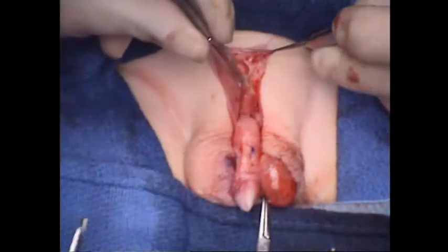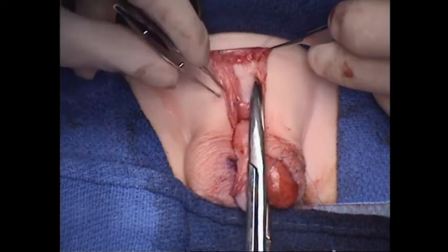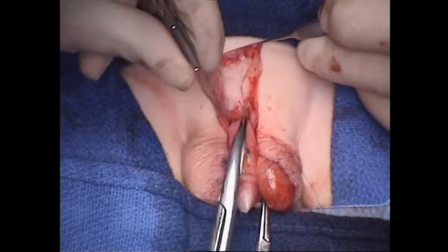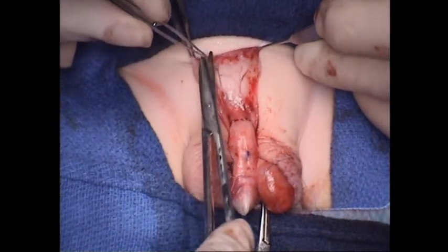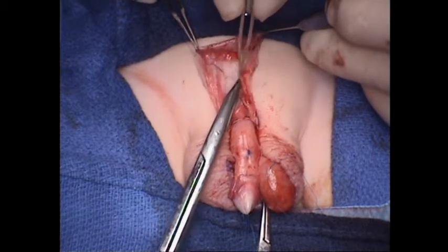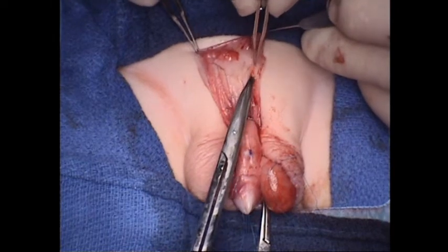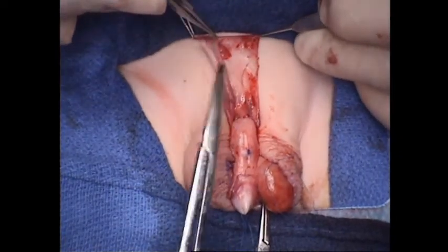So we'll watch as removing this dartos tissue starts to unfurl this skin. How big it gets. We will have way more skin than we need on this case. Now oftentimes we don't need to go here in the midline and remove every last ounce of dartos, because a lot of times where you're tethered is out here laterally, and then of course at your junction here, distally, the junction of the inner and outer prepuce as we spoke of a few seconds ago. So down lower than where the graft is going to be, we may not have to remove all the dartos, but out where the graft is going to come from, all of that dartos has to be removed.